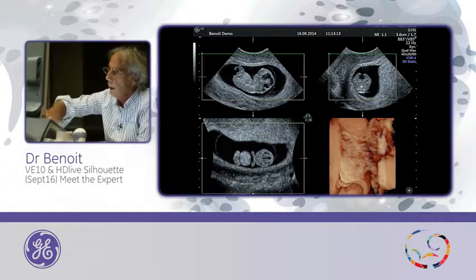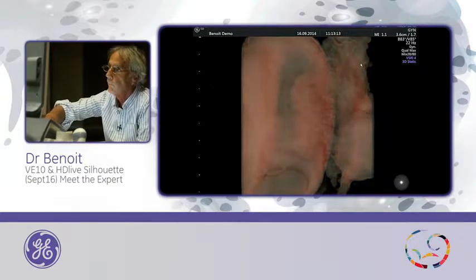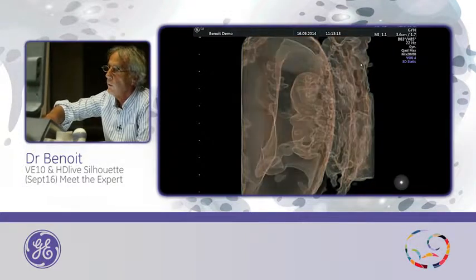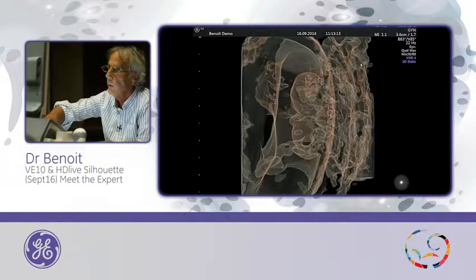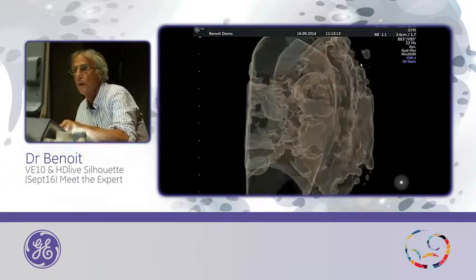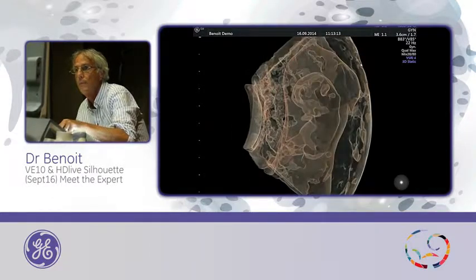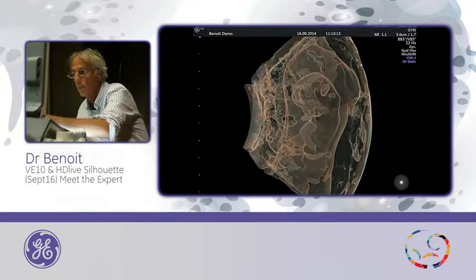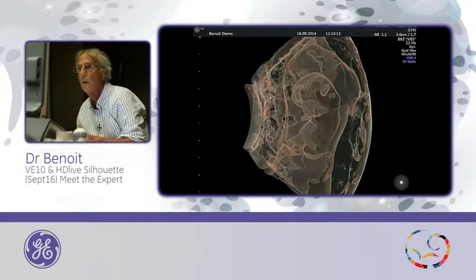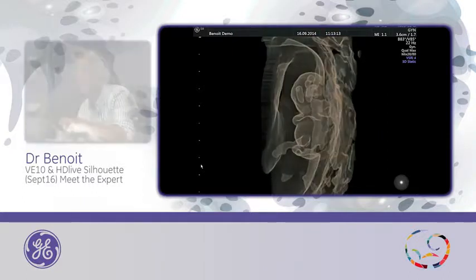This is a random mode with the HD Live, but what you can see here is only this green line, the surface. And when you increase the silhouette, you can see with transparency the embryo inside, and now we can turn around. With this, it's really easier now to use a magic cut, because when you use a magic cut, you know exactly where you can cut.